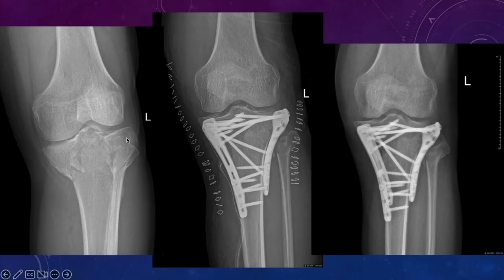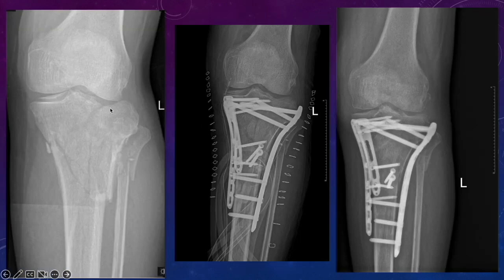So in this example, the depression was lifted, but there was no bone graft substitute. This was the immediate post-operative radiograph. You see there is a raft of screws, and this was after 6 months. You see the fracture has healed well without the loss of reduction or depression of the fragment. This is a comminuted fracture. Again, there is a depression in this zone. We have placed multiple raft screws on the lateral side. Again, this has healed well without any residual depression.